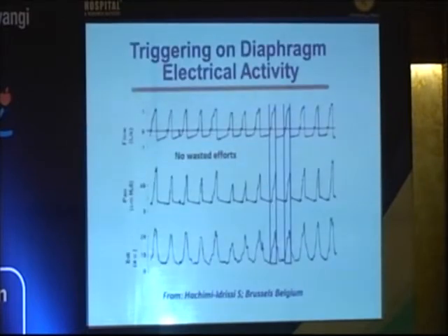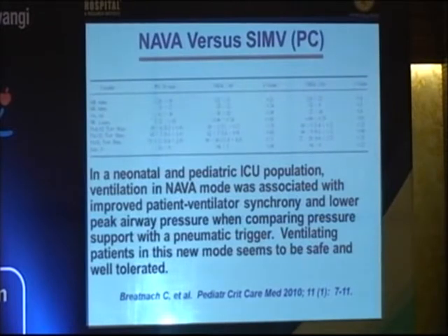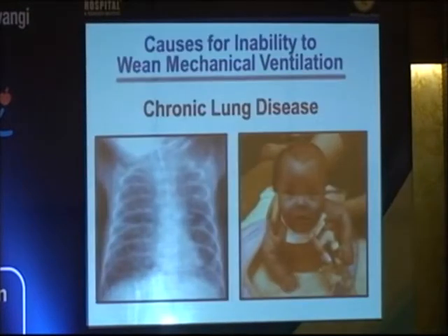So I am not going to talk about this except to say that this is one way of achieving synchrony with the ventilator. Not many of us are using it, but in at least a few studies in neonates, it has been shown to not change vital signs and perhaps decrease the amount of support that is needed. I'll let Chris really give you the details on that.